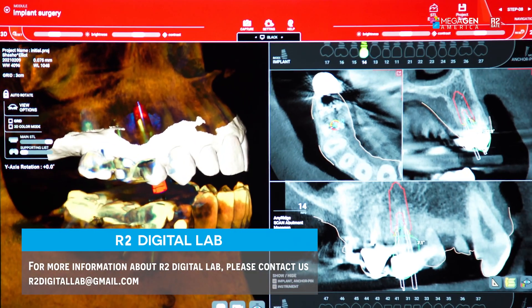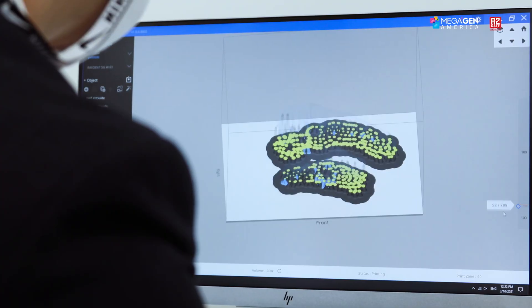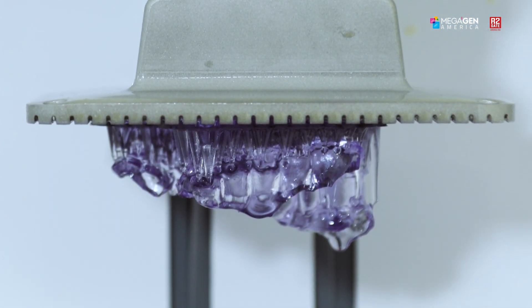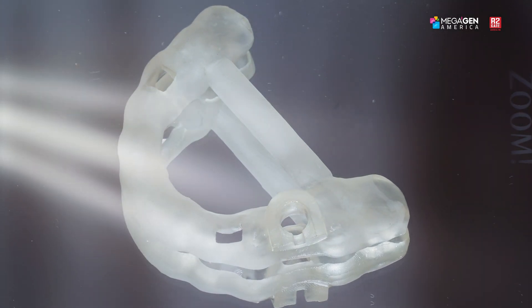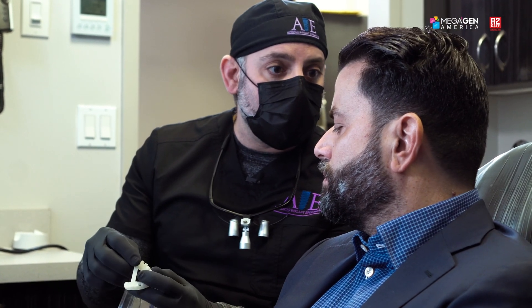So the surgical planning is done. We sent this over to our laboratory and fabricated a surgical guide — a 3D printed guide made by combining the data from our impression scan with the data from our X-ray scan. We actually printed this out on a model so we can have precise accuracy in drilling for placement of our implant.